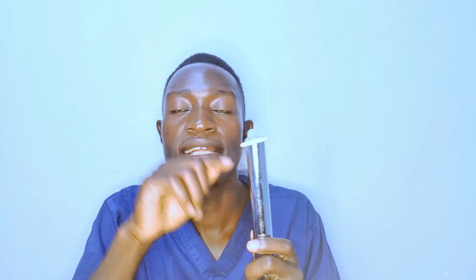Before placing the condom on the head of an erect penis, you can consider putting some lubrication to increase the sensitivity. Here you can place just a small amount of lubrication. Do not put excess lubrication, because you are increasing the chances of the condom slipping off.